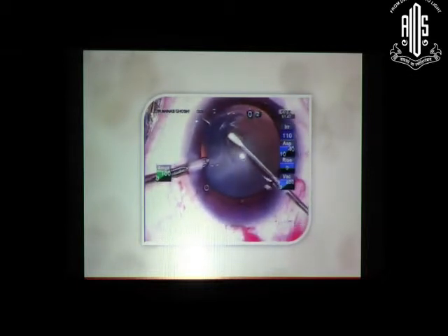This is a high myopia. So we started surgery, paracentesis, then temporal limbal incision, then capsulorhexis. So already I told that proper sizing is important, it should be 5.5 millimeter, so you must be very careful in doing capsulorhexis in myopia. So see, the whole iris lens diaphragm goes down. This is the lens iris diaphragm retrodisplacement syndrome.